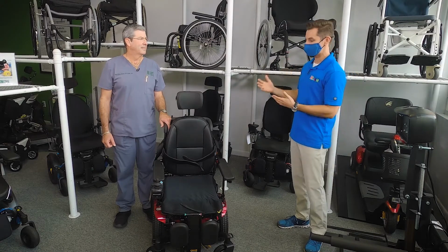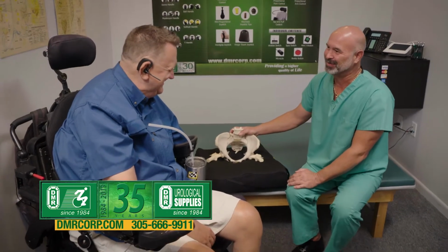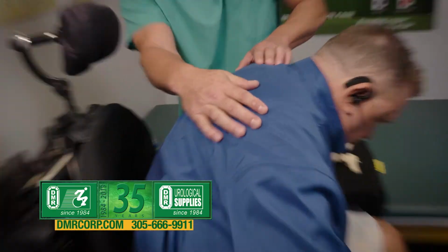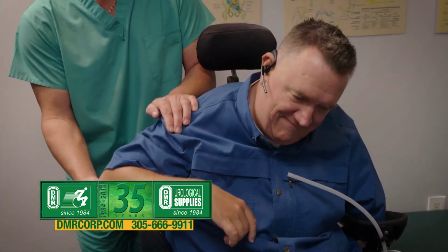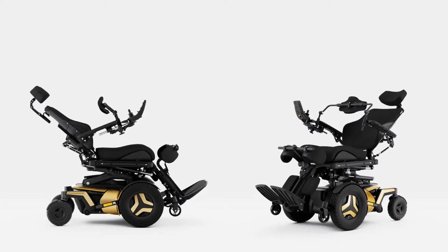Angel, walk me through the process of receiving mobility assistance and how you take care of your customer. Basically what we do is we personalize it to the individual consumer's needs. The first part would be an intake process from our customer service, making sure that they have the appropriate diagnosis for what we call a complex wheelchair, or Medicare calls it a Group 3, which means it has the three most important seat functions: tilt, recline, and power legs.